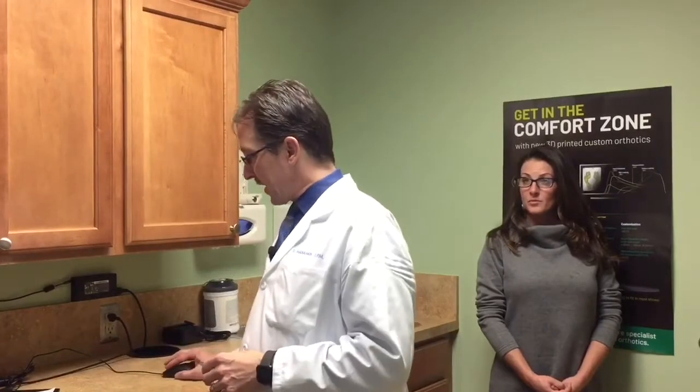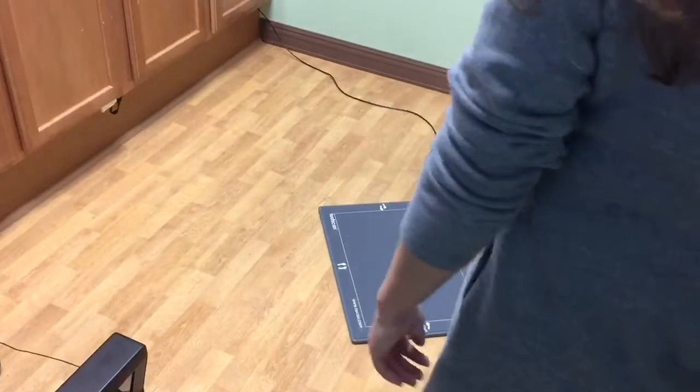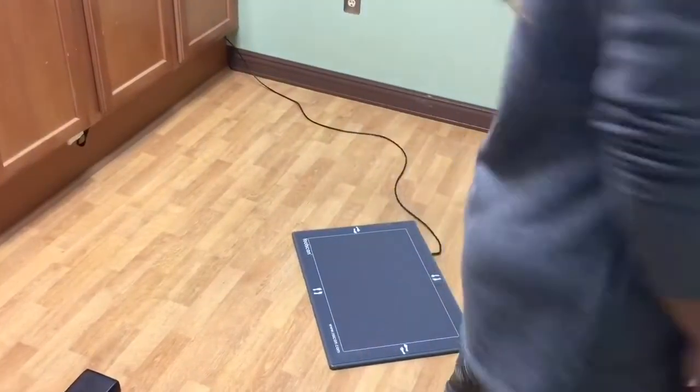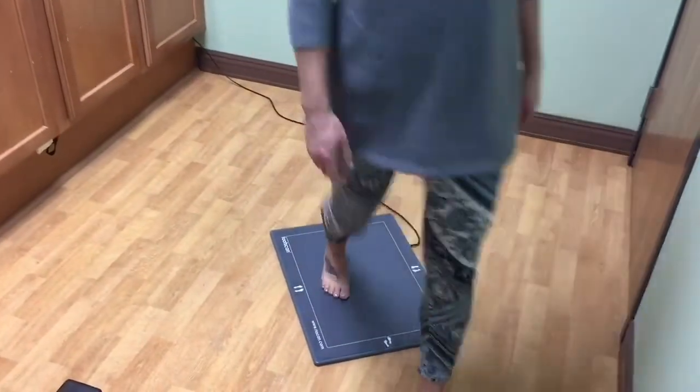So you saw the 3D laser scan. Now we use the gait plate device. With the gait plate, we can do a static analysis and a balance analysis to check for some details. The next thing I'm going to show you is what's called the dynamic analysis, where the patient walks across the gait plate and we capture lots of information about their gait. We'll watch the patient ambulate across, switching feet on each stride, to make sure we capture both feet. We actually do this at least three times per foot. This gives us a wonderful analysis of how she strikes the ground and what happens with her biomechanics.